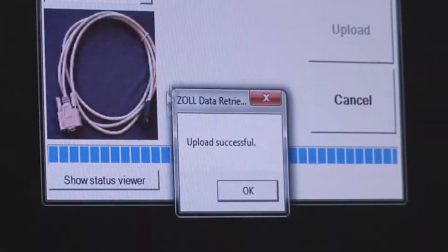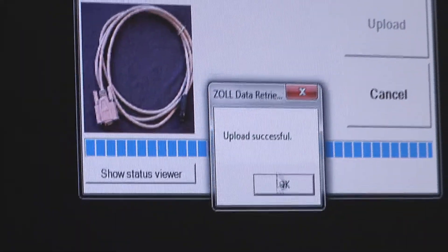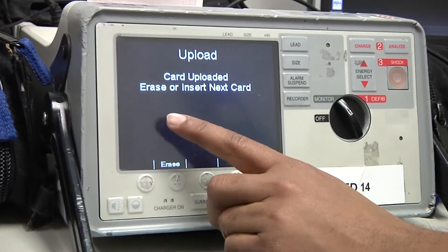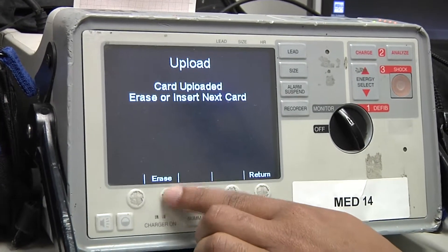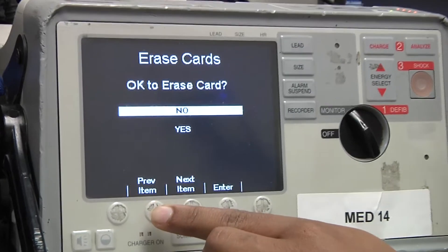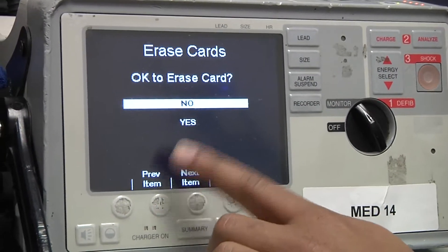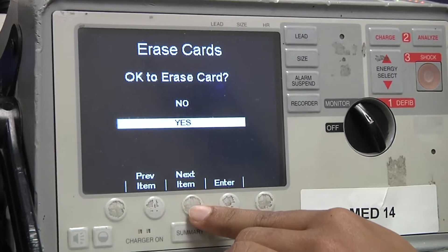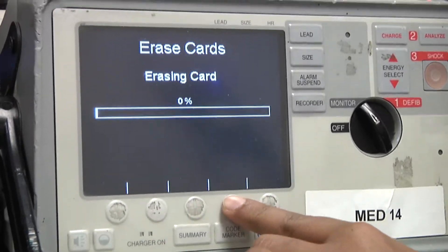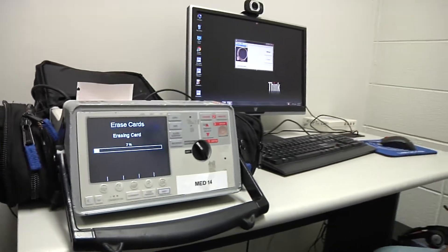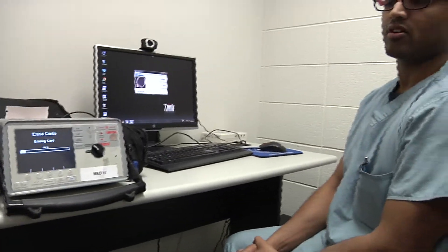You'll see right here on the computer that the upload was successful, so I can go ahead and click OK. Coming back to the monitor, it says erase or insert next card — I always want to clear the card after a successful upload. I'll click yes, go down to yes, press enter, and you can see it erasing the card. Then wait until it reads 100 percent.